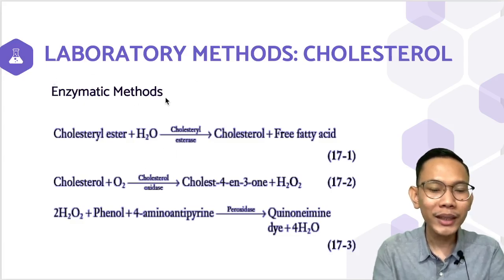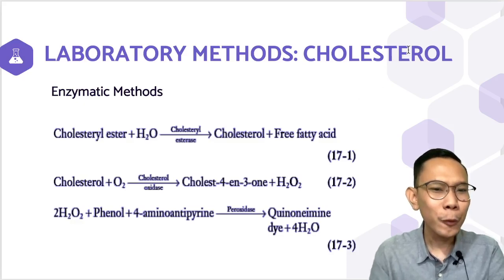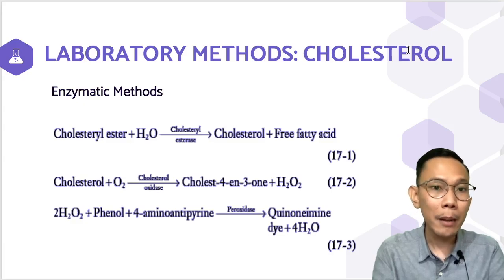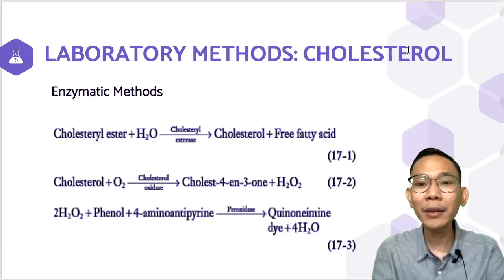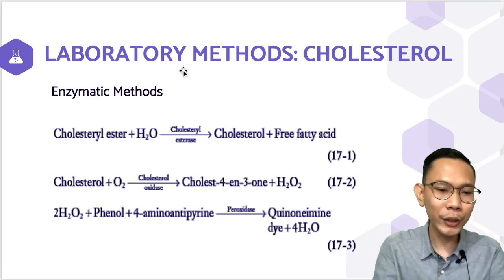So again, how does your enzymatic method for cholesterol happen? Remember, what is the advantage of using your enzymatic method? It will use smaller sample volume, no preliminary extraction step, and it is rapid and precise versus your chemical method.